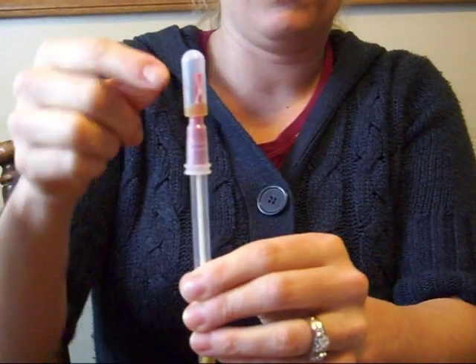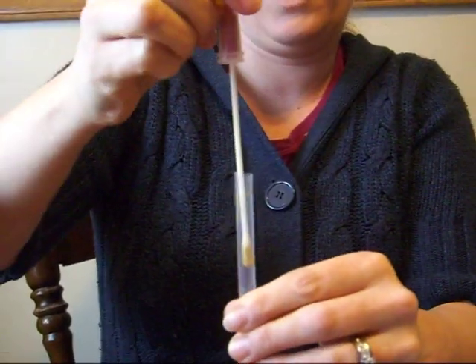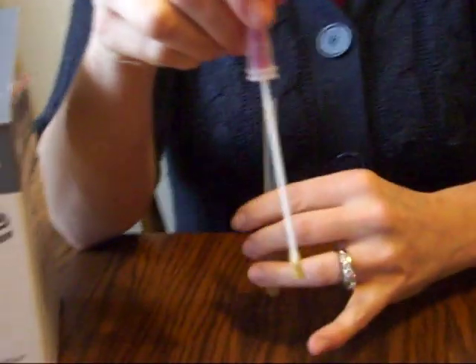Once you're done, the fluid goes all the way back up to the top, and you're going to want to separate it again. Here's where we start using the snap test. If you'll notice on the top of the snap test, we have three chambers.